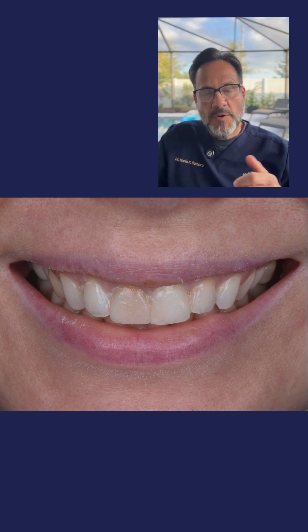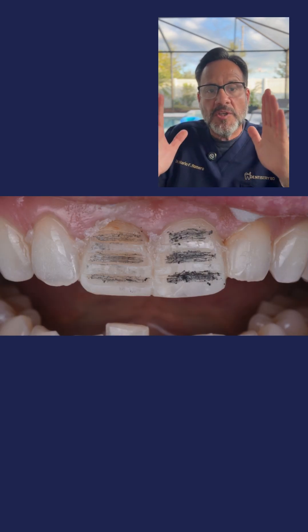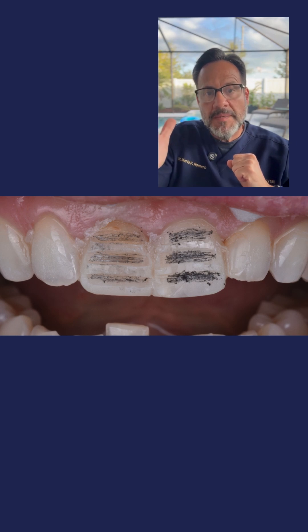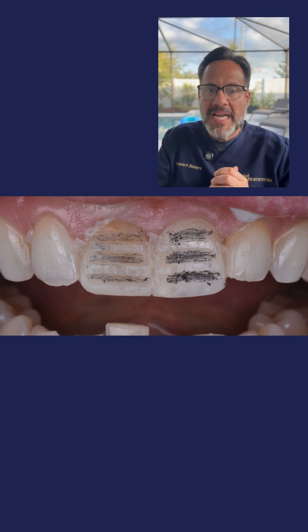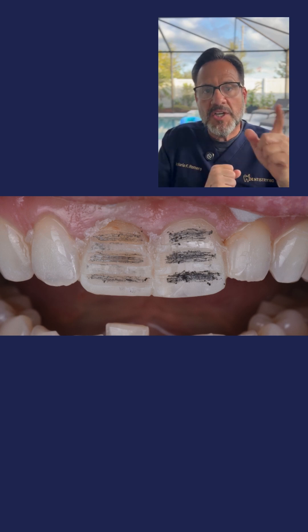Now let's go to photo number three. In photo number three, I've done three horizontal depth cutting guides. On tooth number eight: 1.0 millimeters. And on tooth number nine: 0.5 of a millimeter. Why? Because one tooth is darker than the other.